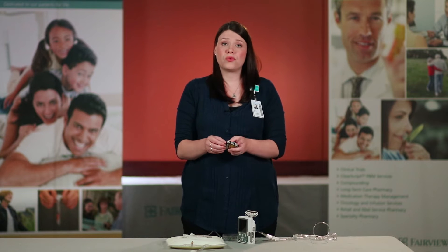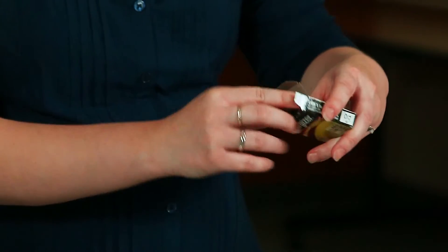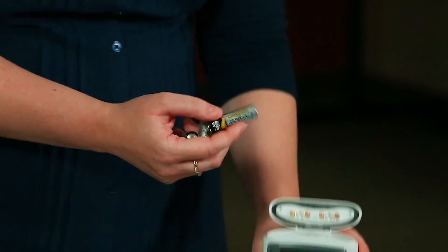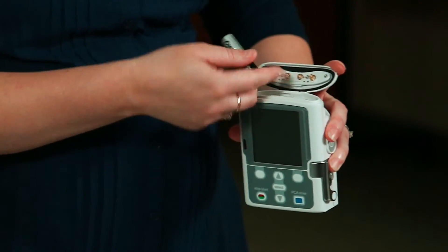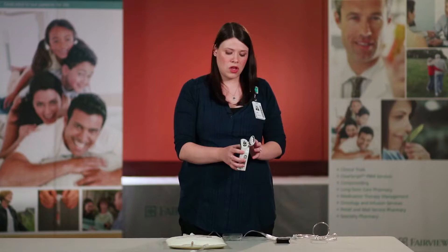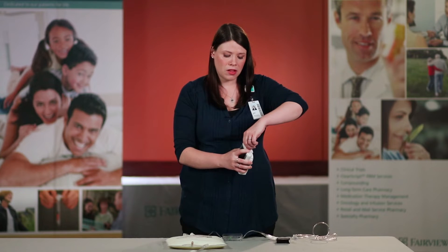You want to use four new batteries. Do not mix old and new batteries, as this can cause a pump alarm for power. Using the markings on the pump and the markings on the battery, put the batteries in the battery compartment. Push the battery door closed and turn the knob clockwise.